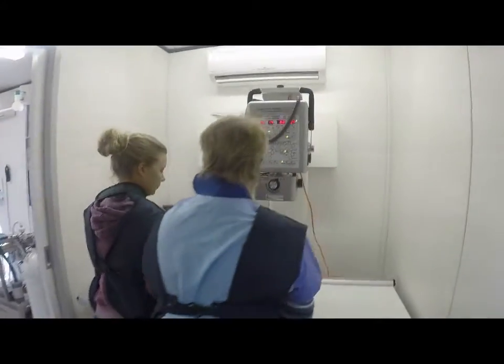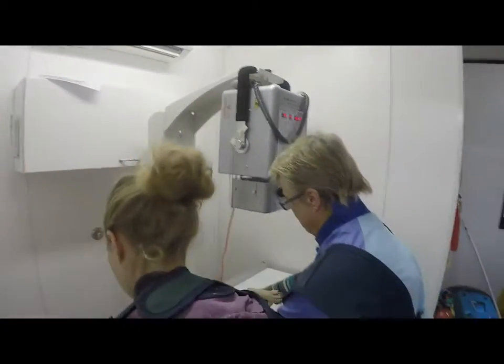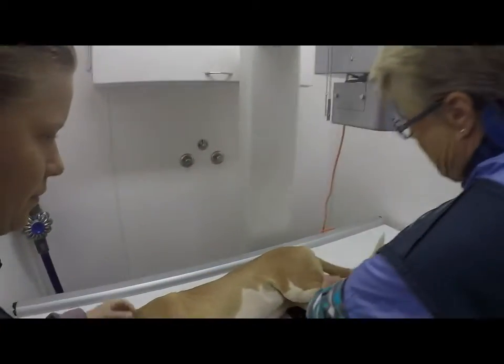So because she is sedated, she is very good at just lying there while we take this x-ray of her funny foot.